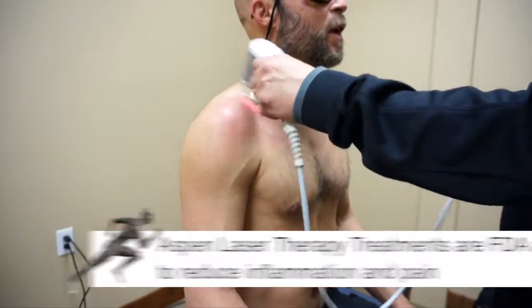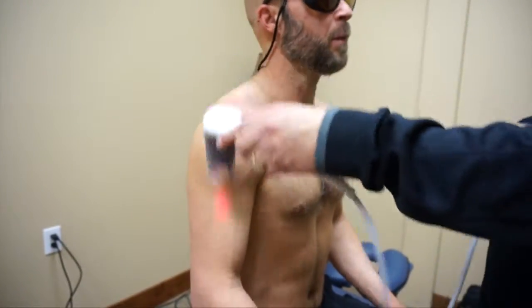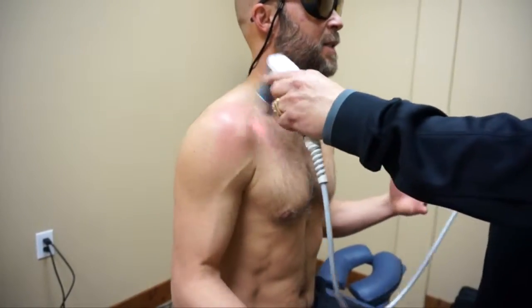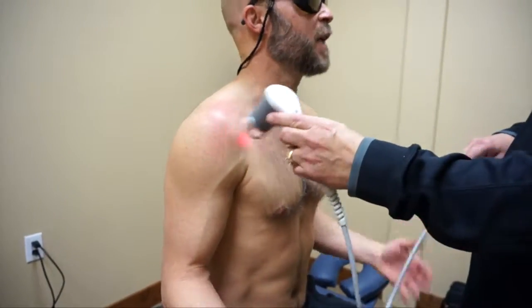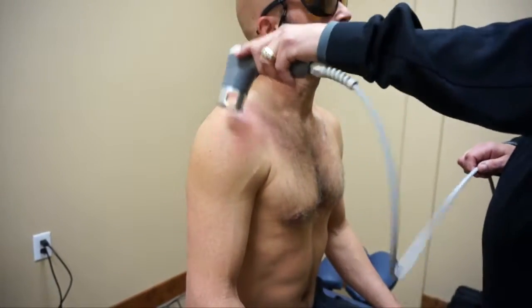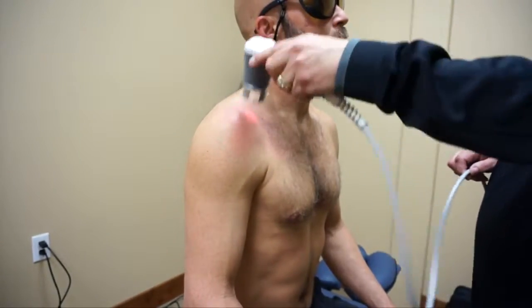Let's say there's a shoulder impingement in your quarterback — could you blast him and then have him go play? Oh, I do that — ready to go. I would be blasting, blasting, blasting the day of the game.